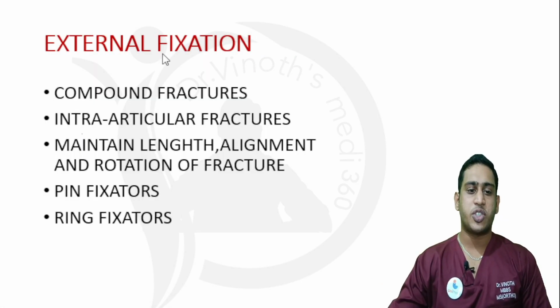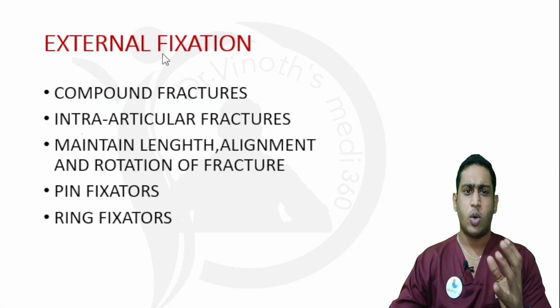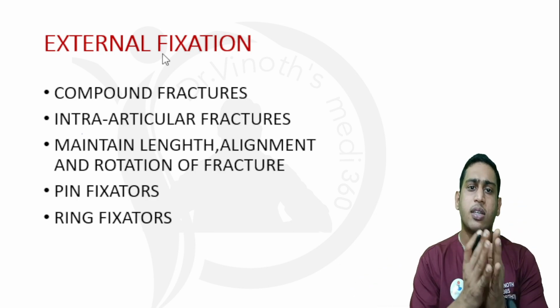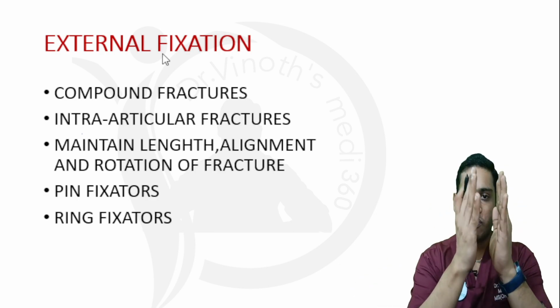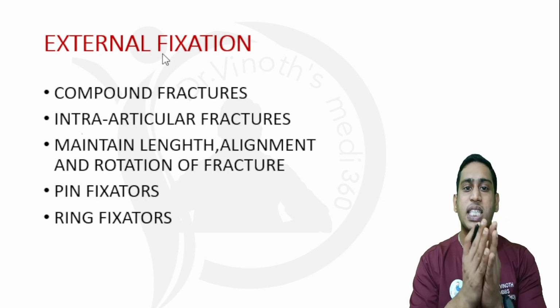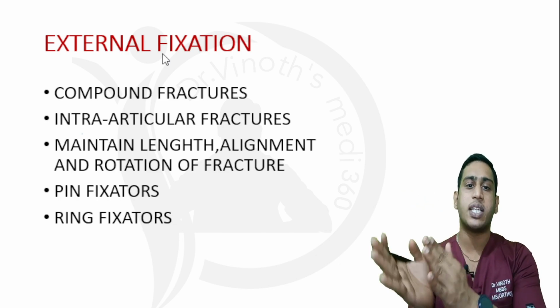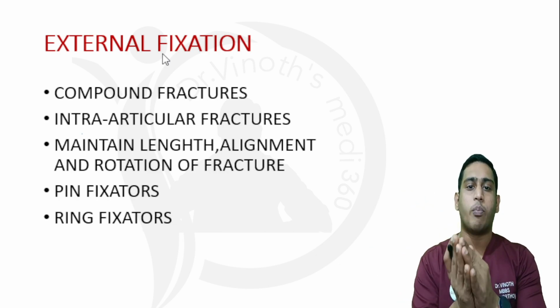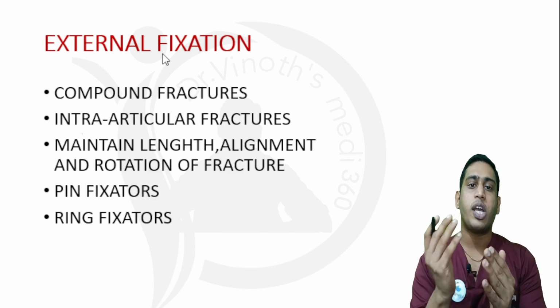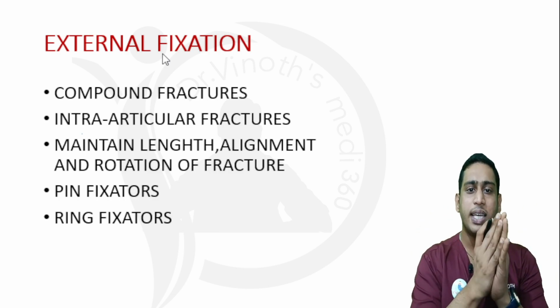Coming to the third section, external fixators. What is meant by external fixator? Comparing with the internal fixators, where the plate or nail will be lying within the body of the patient, here in external fixator, the maximum components will be lying outside the body surface, and only a few components like pins and the K wires will be lying inside the patient's bone, or they will be lying internally.